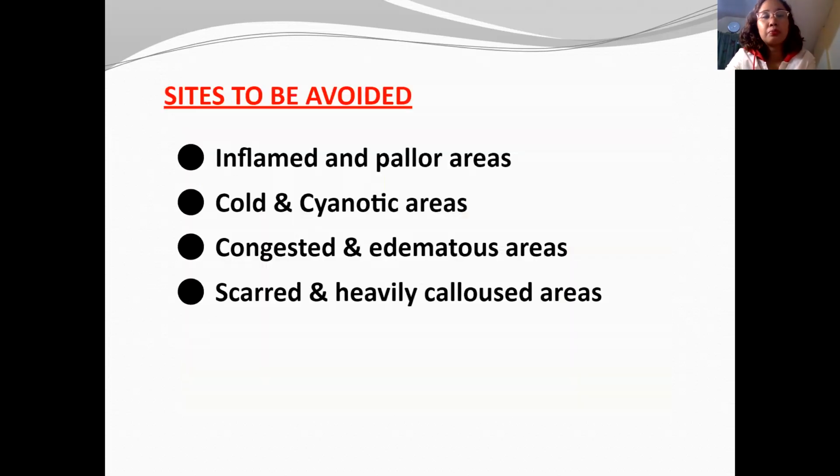So, sites to be avoided: inflamed and pallor areas. If it's already red, don't puncture it, friend, okay? For cold and cyanotic areas, expect high hemoglobin in these areas. Avoid areas with congestion and edema, where there is increased accumulation of fluid. You will get fluid there, not capillary blood.